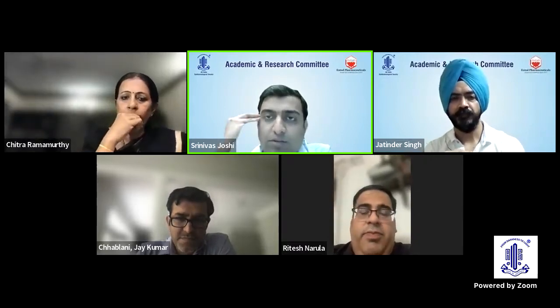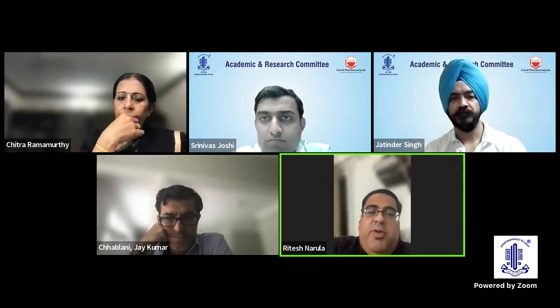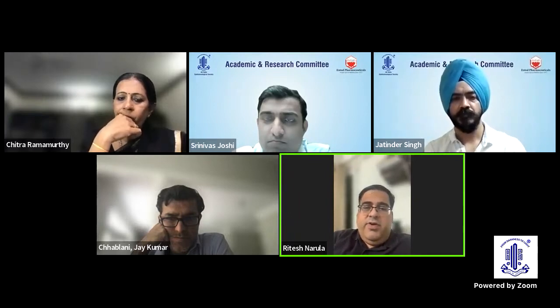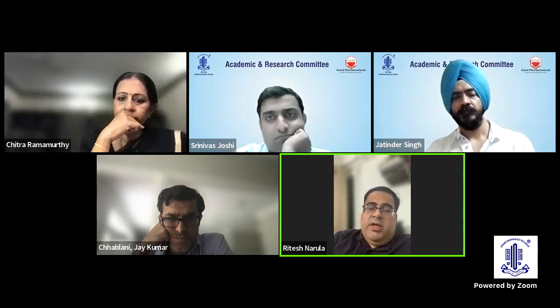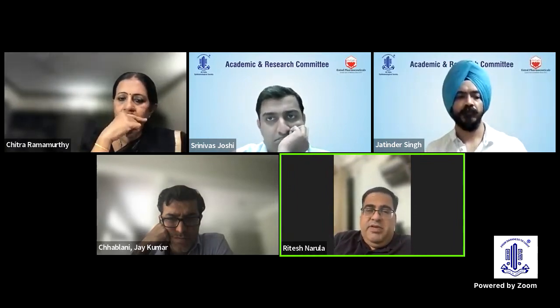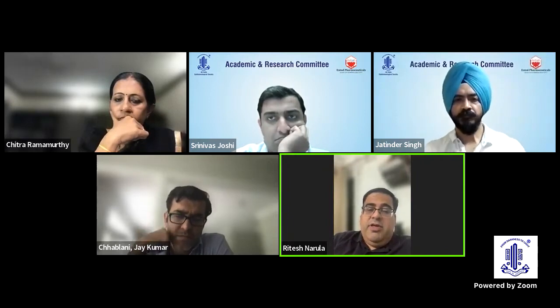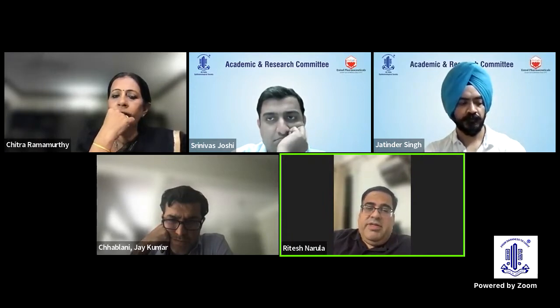Yeah, Ritesh bhai, please go ahead. Yeah, I have looked at these morphological networks purely on the basis of whether to look at them as active or dead networks. So we look at the pruned tree appearance, the loops and the perilesional halos. Regarding comparing BVNs with PCV in terms of these morphological parameters, I don't think I have really looked into it. I still go by what Dr. Jatinder put up in his last slide. If I identify a polyp, I pick it up as PCV on OCTA. Otherwise, it's practically very difficult to differentiate the two kinds of networks.